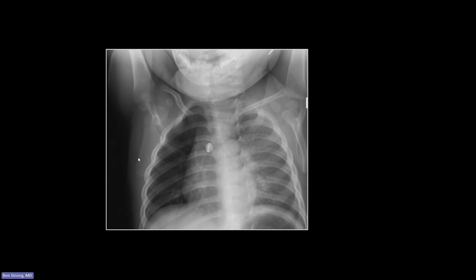This is always mistaken for a snap, but it's not. There's nothing else on this film — no hospital gown or EKG leads — to suggest it's a snap. It's sitting right over the hilum, right where an aspirated foreign body would go.